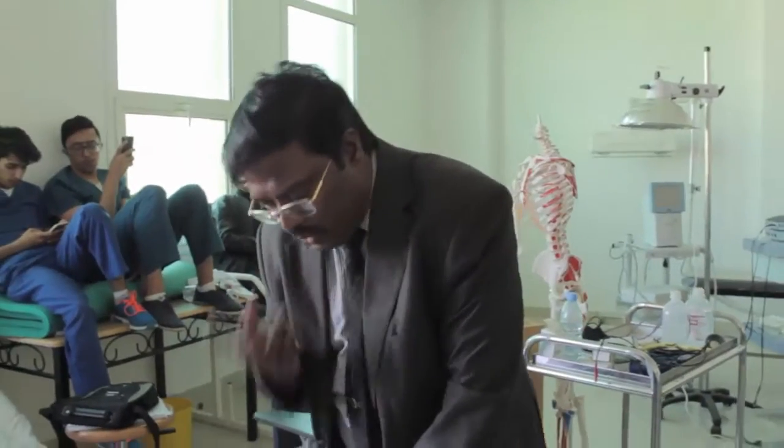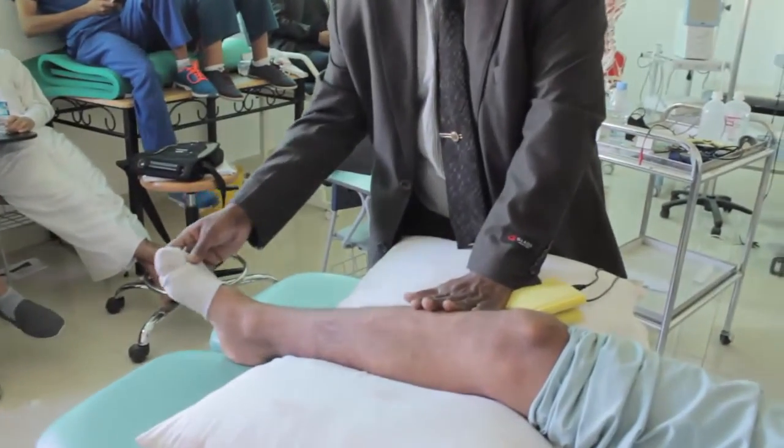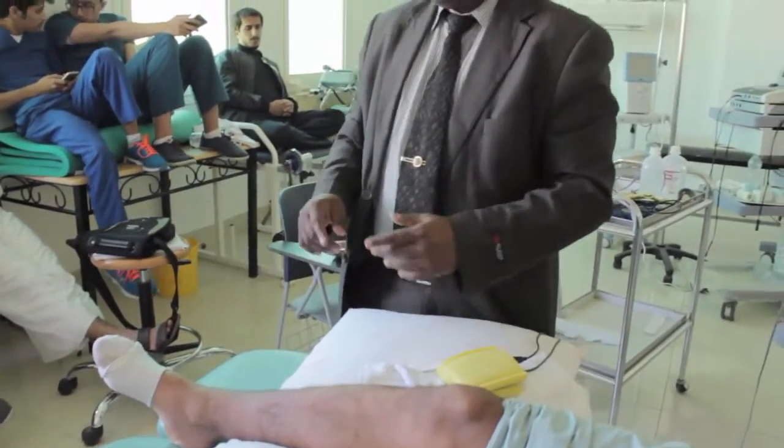Now intensity, how much current should be increased? It is dependent upon the patient, but usually when you want to strengthen the muscle, you have to see the muscle contraction. When you keep the electrodes on the muscle, you should see the movement of the body. Then only you can say it is sufficient intensity to produce the muscle contraction. That is second, about intensity.